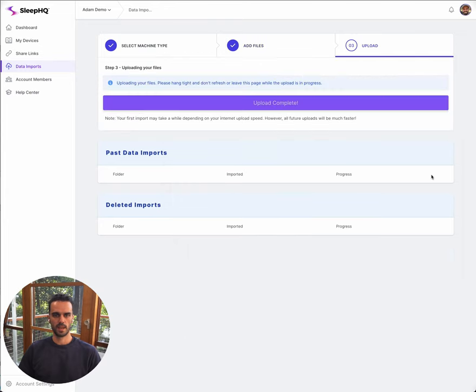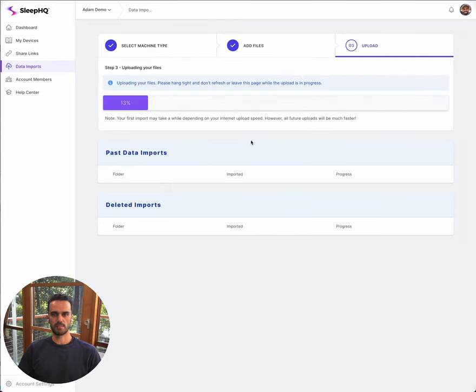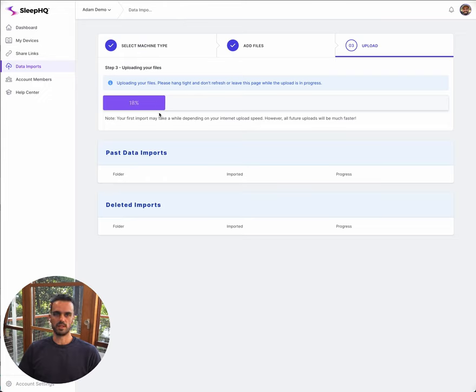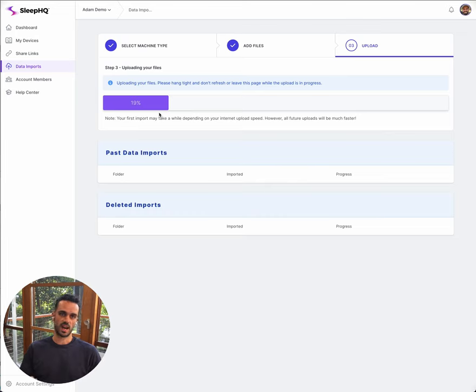Now the very first time that you do this, it might take a little while because it's got a lot of data to upload. However, every time you upload new files, the system will automatically keep track of everything that you've uploaded previously.